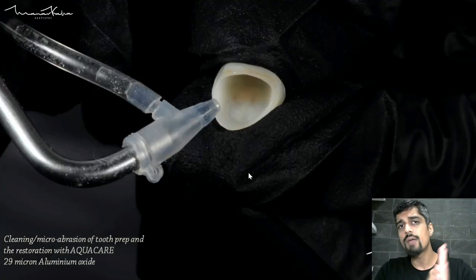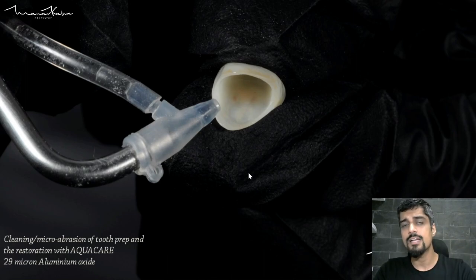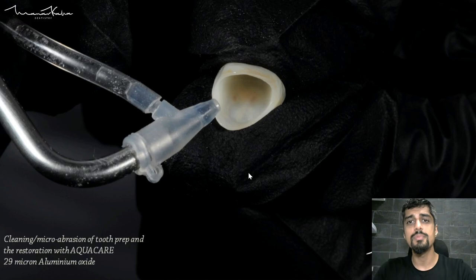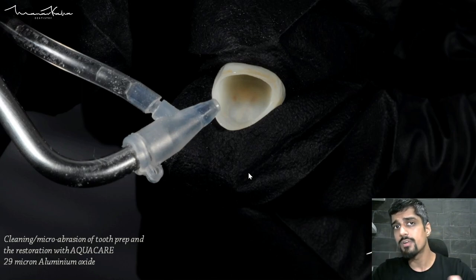Not only do you have to clean the tooth, but you also have to clean the restoration. For the restoration, I am again blasting it with my sandblaster. If you do not have this, you can simply clean it with alcohol. When you have done the trial in the patient's mouth, there's saliva and salivary proteins — alcohol is an organic solvent, it's going to help clean all that surface away.